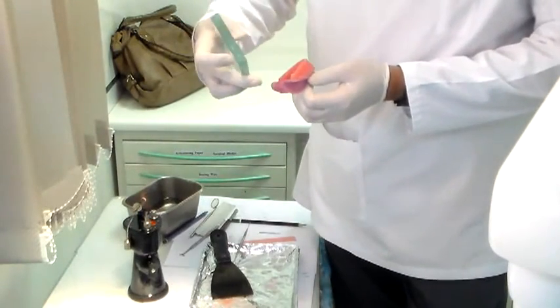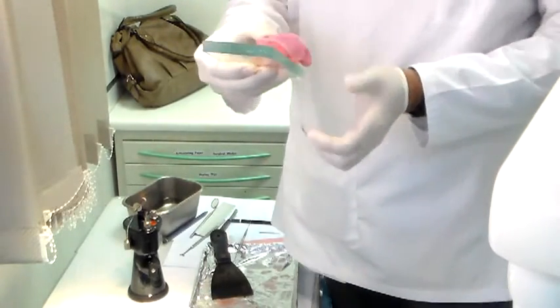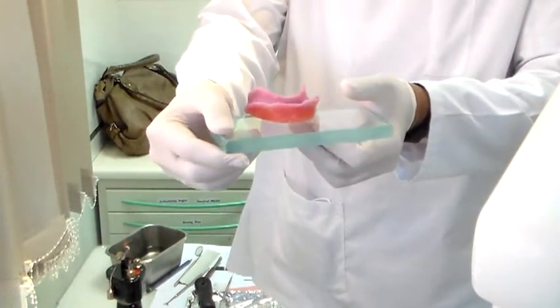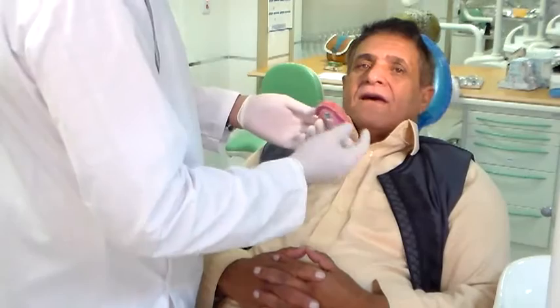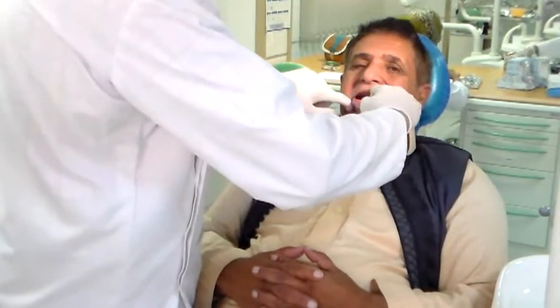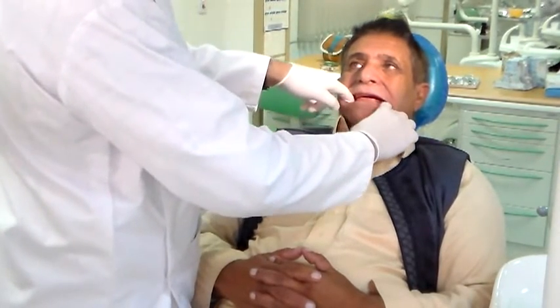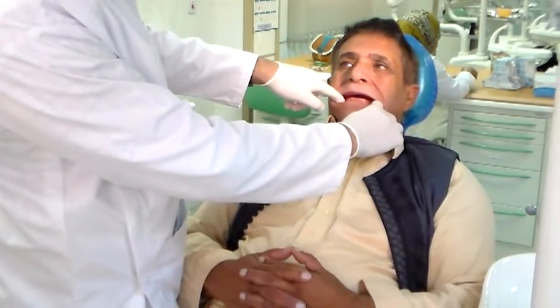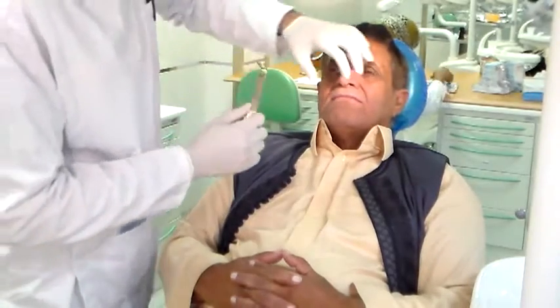When you check the plane for the lower, you want to leave the acrylic heels out. You check the plane like this. So we're going to go in with our lower occlusal rim. Place it without touching the occlusal aspect. Now as it tries to close again, you can still see first contact is still here. This is still open, right? Do we still have to reduce or not? You will know by measuring.